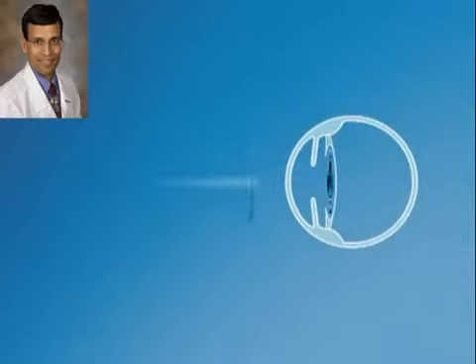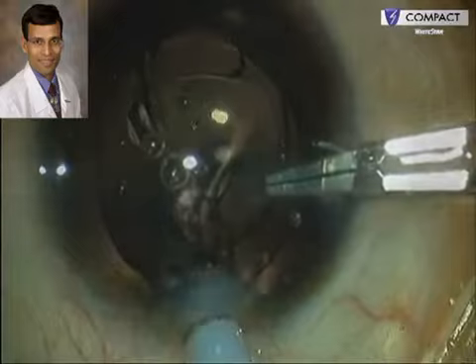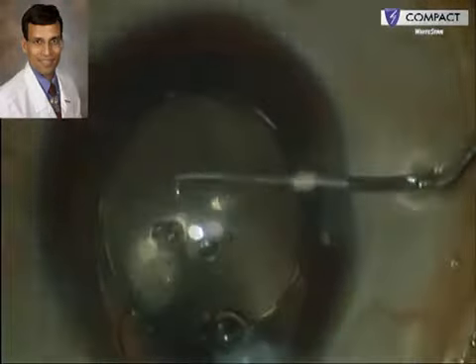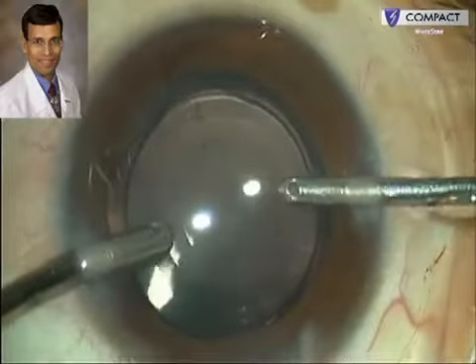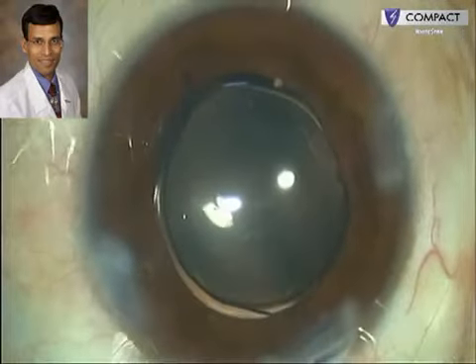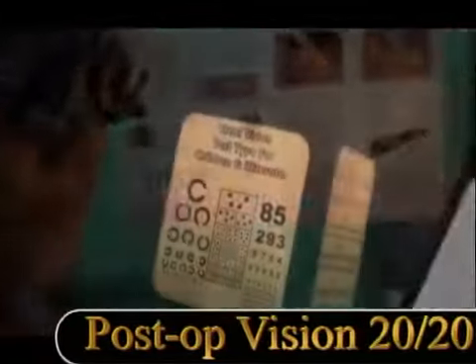This hydrophilic acrylic IOL is placed in the ciliary sulcus on top of a hydrophobic acrylic IOL previously implanted in the capsular bag. The piggyback IOL haptics can be aligned either in the same direction as the previous IOL or 90 degrees opposite. In cases where a toric IOL is in the capsular bag, care must be taken during secondary piggyback implantation not to disturb its positioning. The viscoelastic is removed from between the IOLs; this combination of hydrophobic acrylic in the bag and hydrophilic acrylic in the sulcus minimizes the chances of interlenticular opacification, or the 'red rock syndrome.'